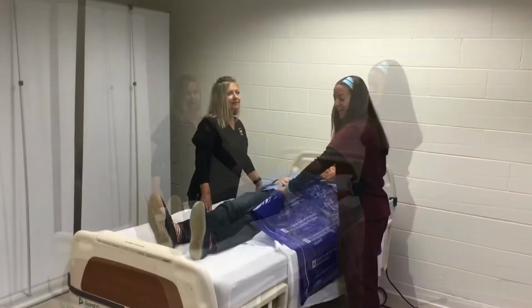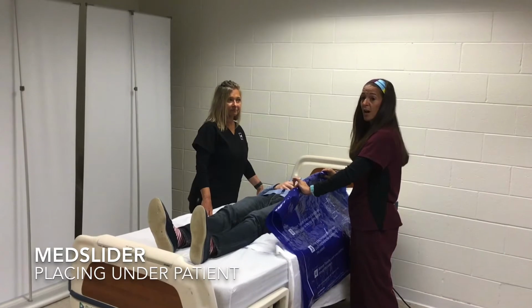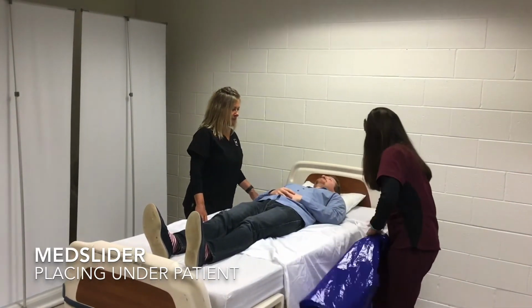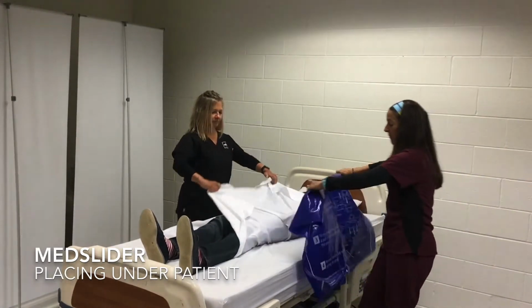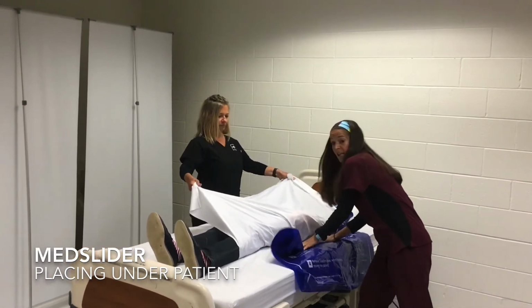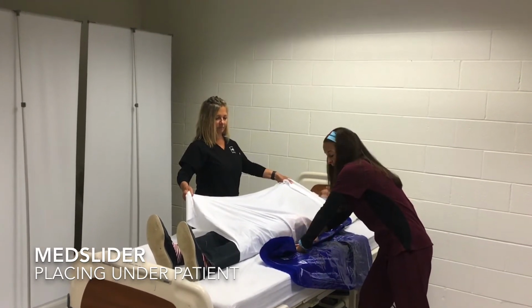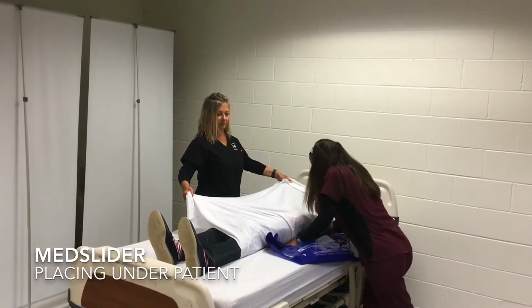In this next portion, I'm going to demonstrate how to get the MedSlider tube slider under the patient if you're unable to log roll them. So again, I'm going to have my other nurse hold this up. And then I'm going to push the MedSlider into the bed underneath the patient, keeping my hands between the patient's skin and the slider to reduce friction. So like so.